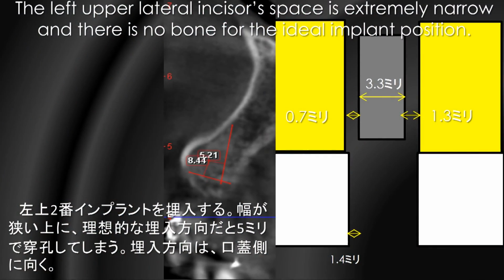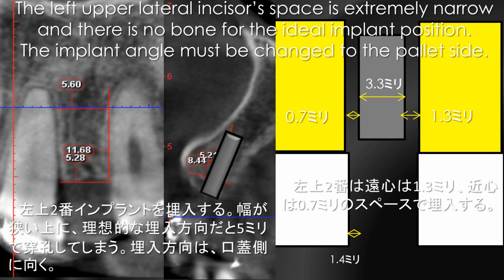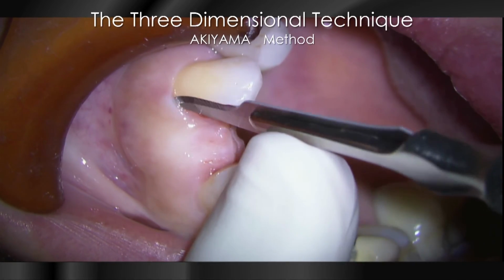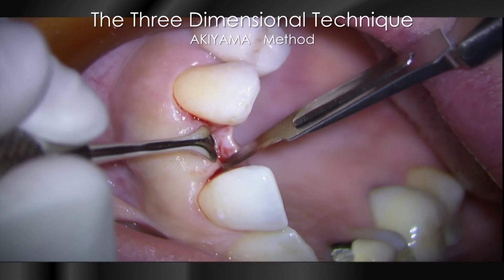The left upper lateral incisor space is extremely narrow and there is no bone for the ideal implant position. The implant angle must be changed to the palate side. The three-dimensional technique. This is my technique. So, I place the implant in the left upper lateral incisor area.